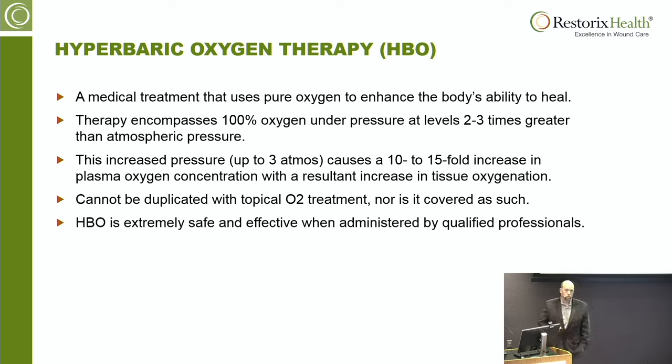Now, pressurized oxygen is a fire hazard. So safety is a big deal. We take safety very, very seriously. The staff, the providers, everybody goes through fairly exhaustive and intensive hyperbaric training. Anyone that's going to operate a chamber learns all about our policy and procedure set. I'm a big fan of checklists. You see checklists used in a lot of different places in medicine. We use a lot of checklists in the unit, making sure devices are cleared, making sure everything is done consistently and appropriately before we start that treatment. You can think about it as things like pre-procedural pauses.